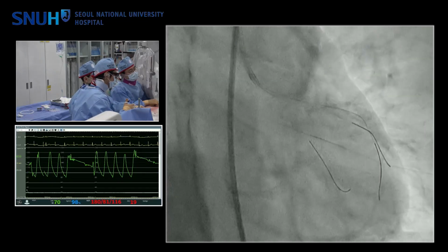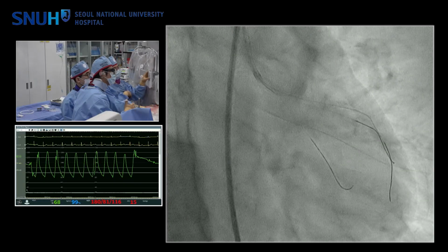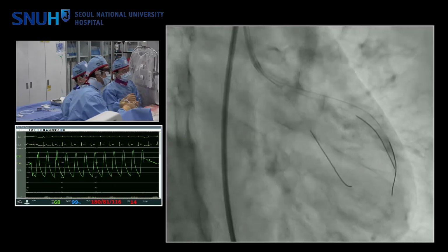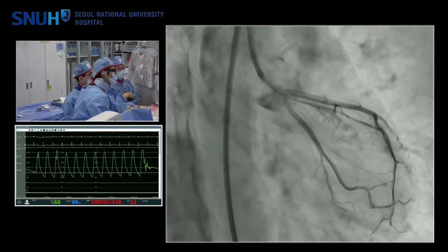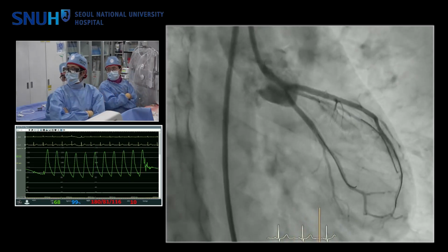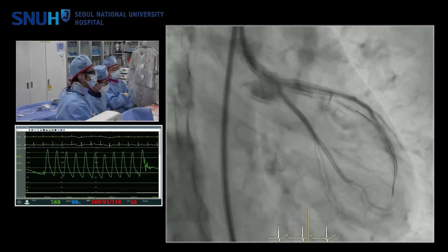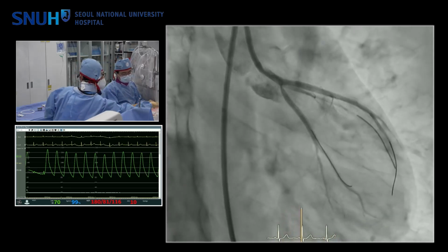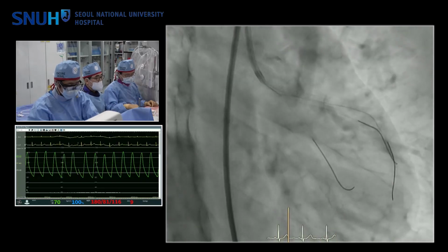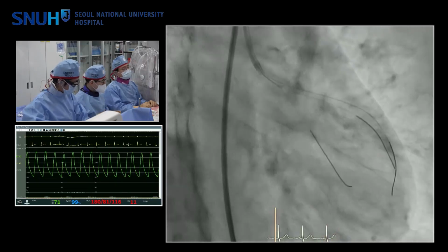If FFR is okay, no additional treatment. Can you measure vFR with this angio? Yeah, we are doing. Okay, please go ahead. While we are measuring invasive FFR, we are going to measure FFR of the circumflex, and then possibly ramus intermedius, and compare the vFR digit.